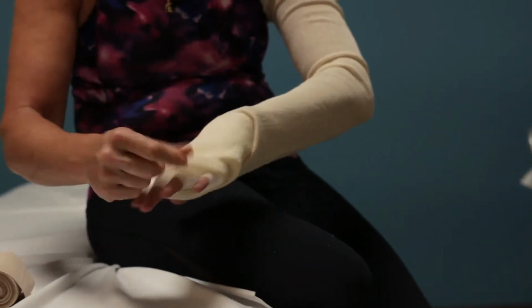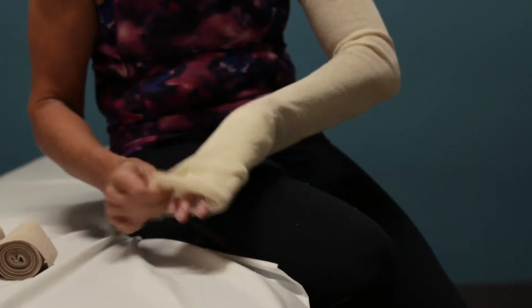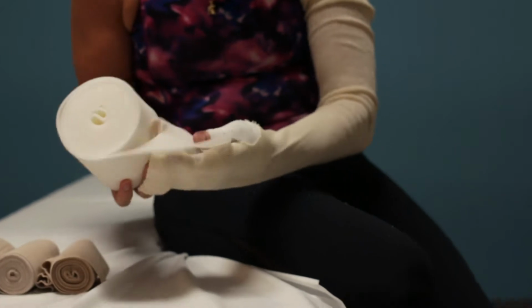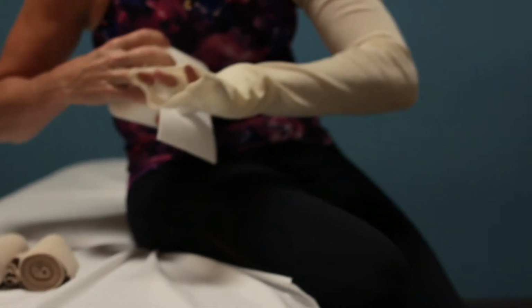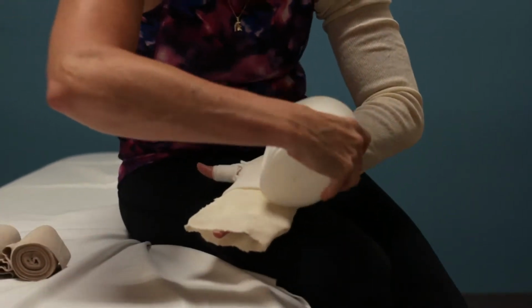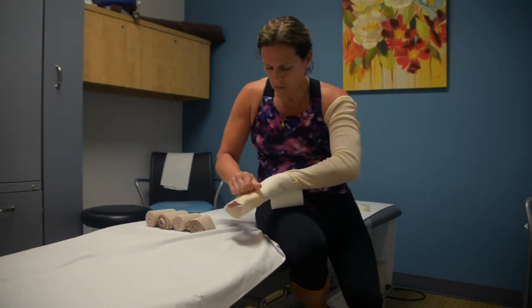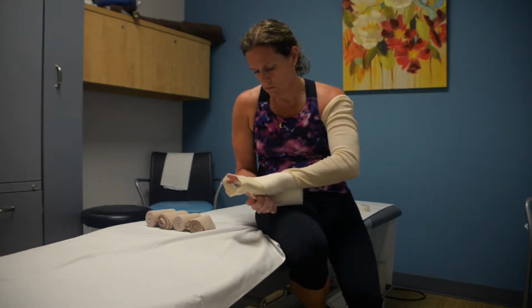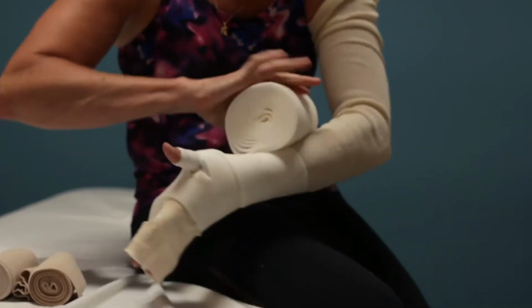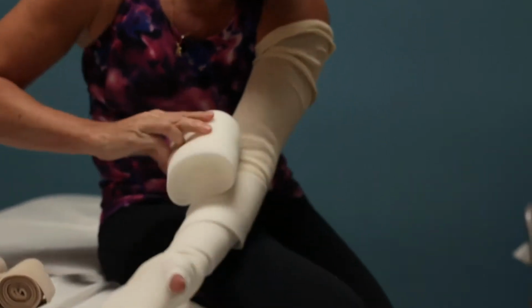So after that, you're going to pull your slip down. You're going to put on your rolled foam. So I've already cut out a spot for my thumb. So you're going to go straight across the back of the hand with your rolled foam. And then you're just going to spiral this up to your armpit. You're overlapping about halfway.